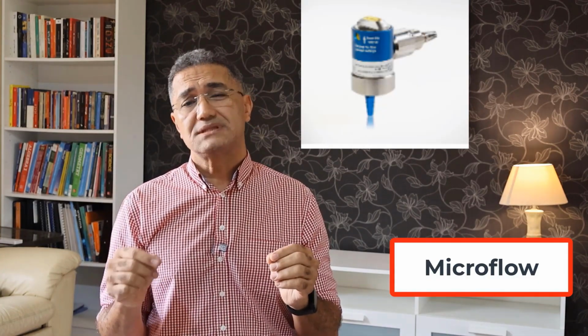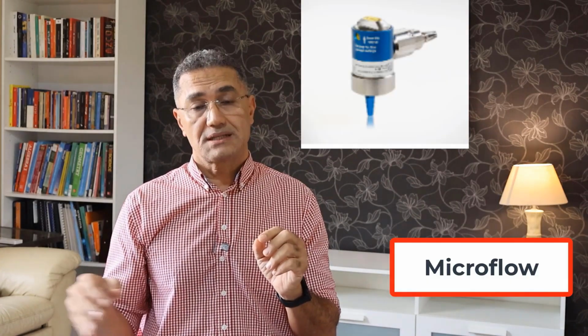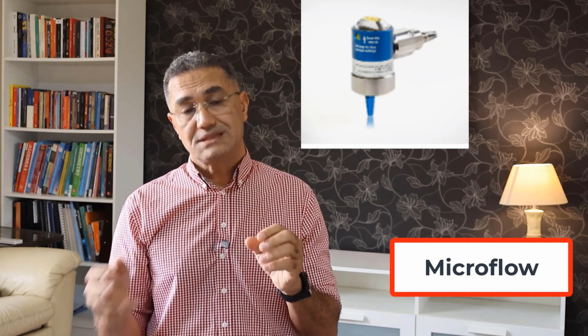As for the microflow, it is a type of machine that we commonly use whenever we need to deliver a flow of less than 1 liter. It starts from 0.8 and goes down to as little as 0.02. So it comes in different grades. But you need to understand something important about the machine. It is connected to the flow, and the flow itself has grades, as we mentioned: 0.8, 0.6, 0.5, 0.4, 0.3, down to 0.1, and then it continues to 0.05, and so on until 0.02.